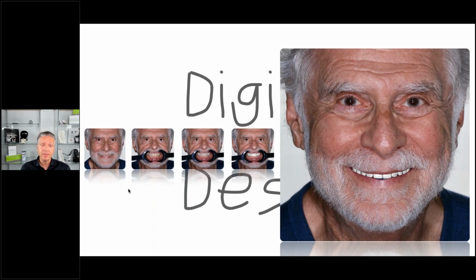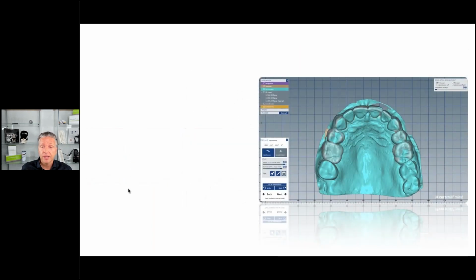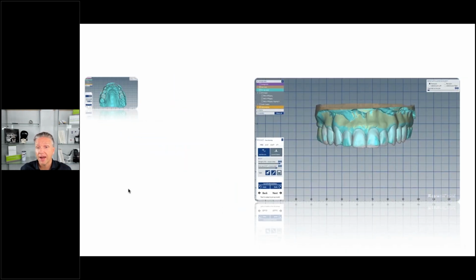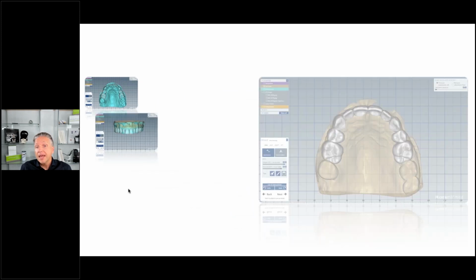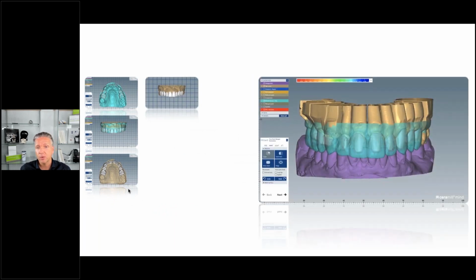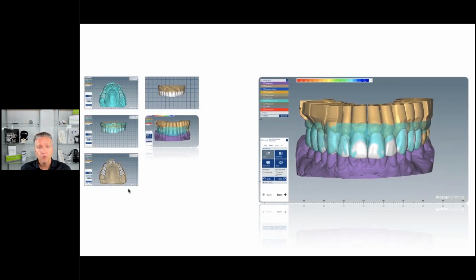Of course. We actually started at the same time. Let me move back a little bit. When we do that smile design, we have a split screen, and you will see this a little later, where on one side we design the smile in 2 dimensions, but in reality we put all these teeth in 3 dimensions on these STL files that you see here. So we're actually making a digital wax up with his photos in mind. Of course we can do that because we already planned it properly. Let's move back one more slide.